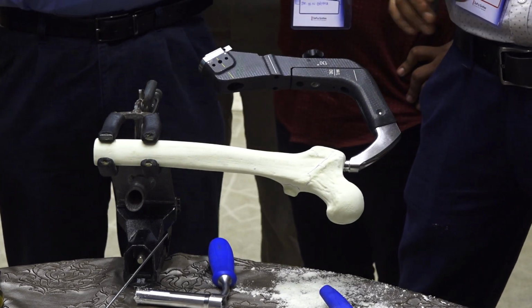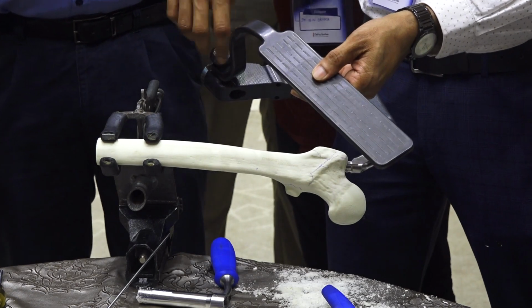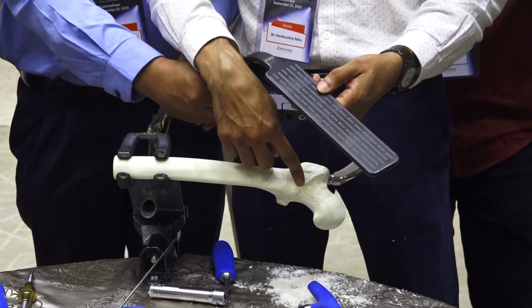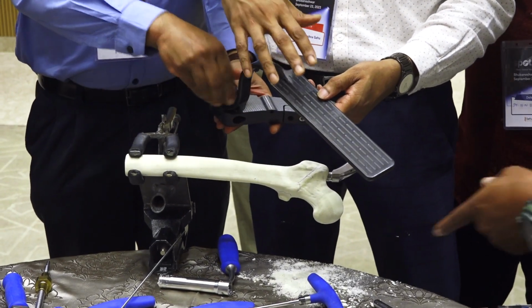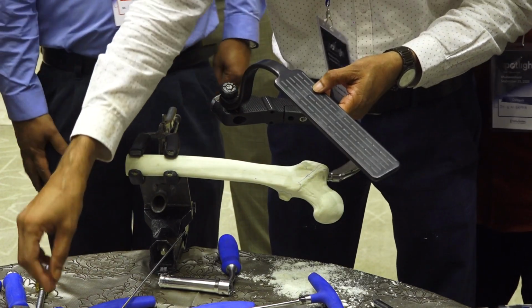And this is the jig for checking the position of the helical blade in the neck. You shoot the C-arm under fluoroscopy. These are markers. You match the nail.